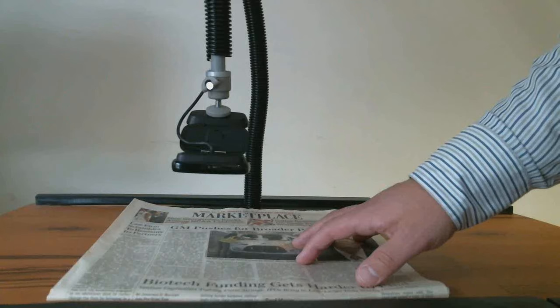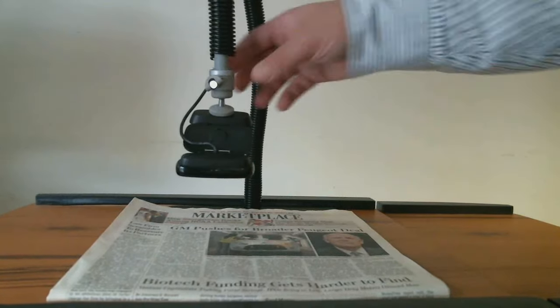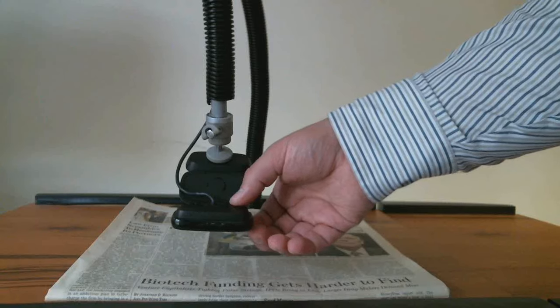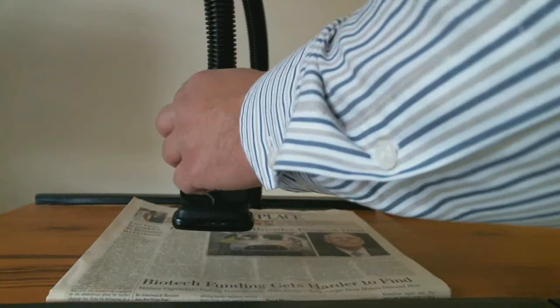You want to mount the camera directly above what you're trying to read, and again, no more than 4 to 6 inches. You can even go a little bit closer if you wanted to. You have to be about 1 inch to 1.5 inches away. That's the minimum focal length of the camera. It is an autofocus camera as well.